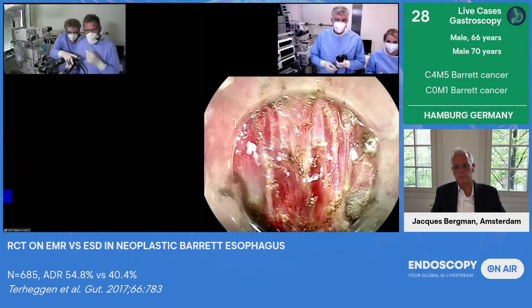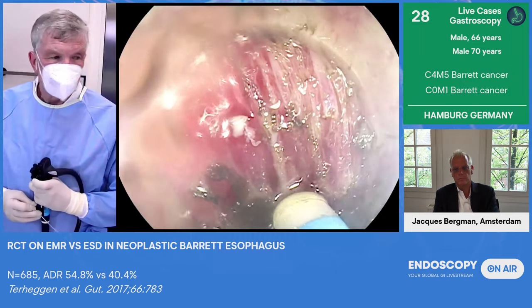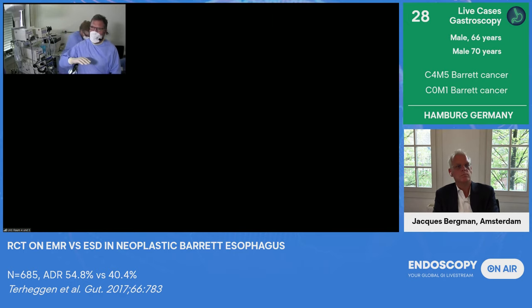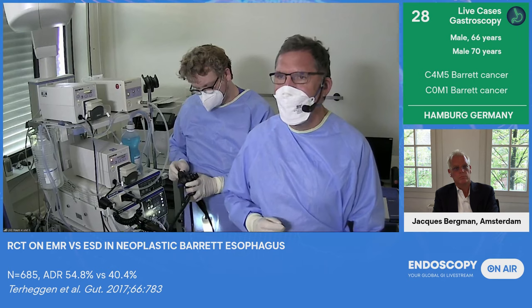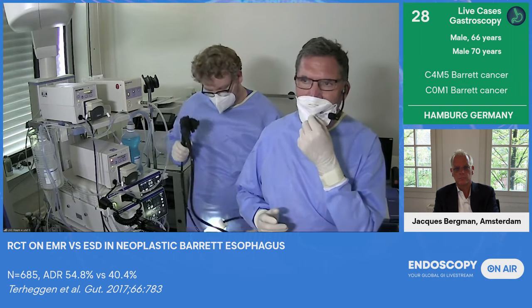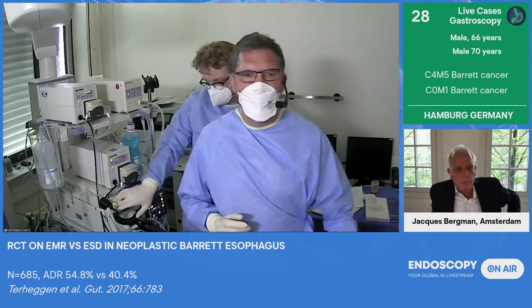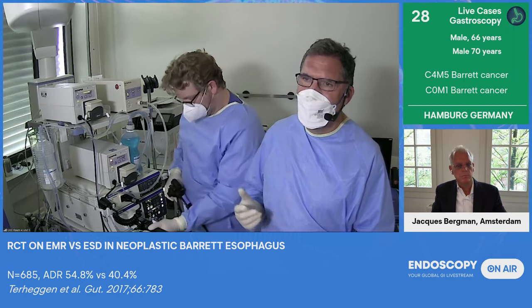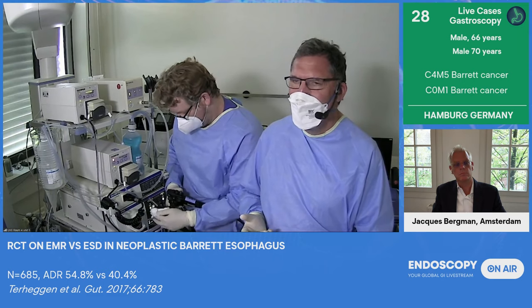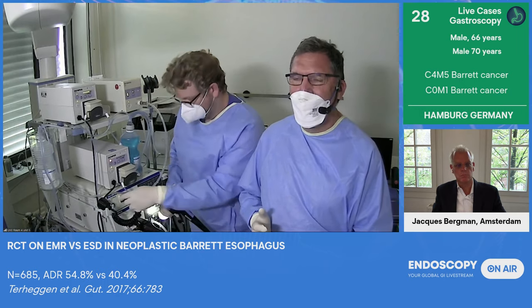Well, as you saw, Jacques is also online. This is a lesion. It's not very huge, maybe 1 centimeter, and below this squamous epithelium, there seems to be the cancer. The surface shows some nodules, the vascularity seems suspicious, and it's a bit depressed. So although it's very small, I think it's a good indication for ESD. In our series, we have meanwhile more than 600 ESD procedures. About 10% of Barrett cancers had been pre-treated, and the R0 resection rate from the naive Barrett's is about 80%, and from the pre-treated 70%. So it's still possible, it's a bit lower.